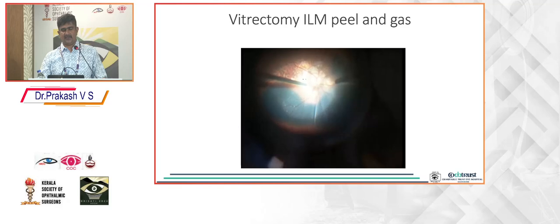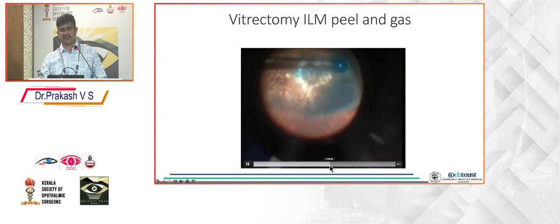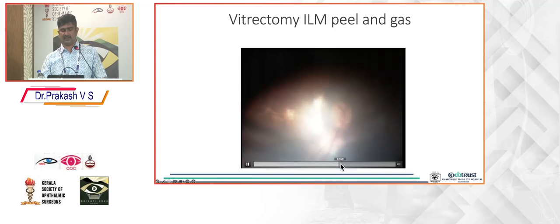And as you aspirate, you can see the dye coming from that area. So that is the break, because of the lack of contrast, because you are seeing bare sclera there. So you cannot normally make out the break unless you use this technique. Here I can see the dye is coming out through the hole, and so I identified the break, which was cauterized, and then the surgery was completed after doing complete internal limiting membrane peeling. All the vitreous remnants were removed.